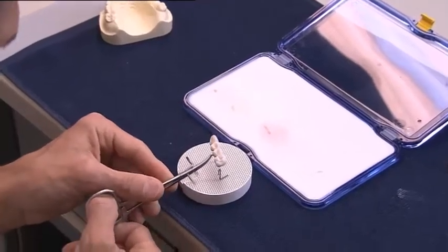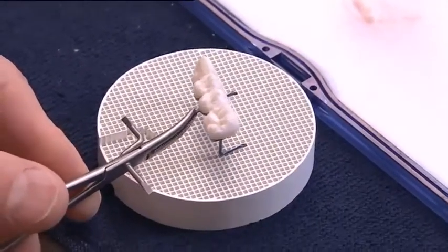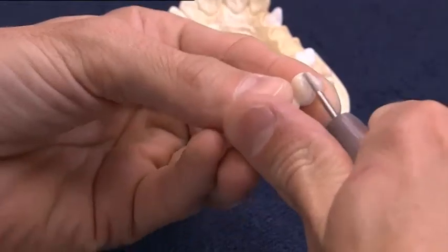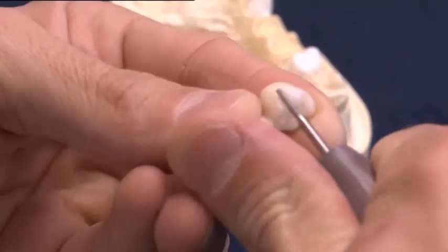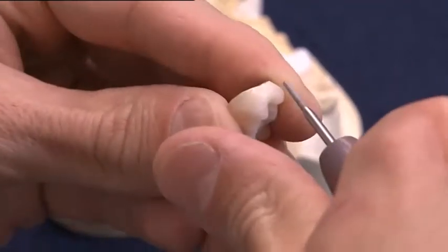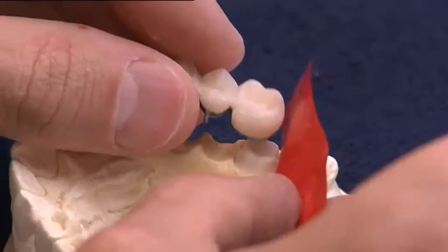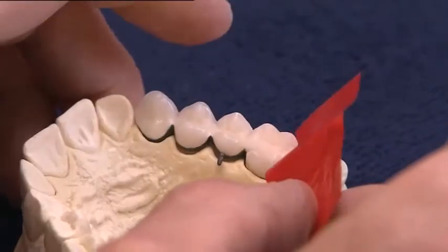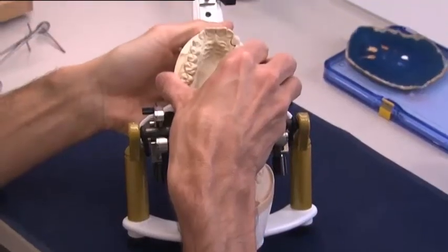Provide adequate support for the restoration on the IPS Unitray and fire the bridge in the Programat furnace. After the second firing, the surface structure is designed and growth lines are applied so that the light is refracted and reflected in different ways. The contact points and function are checked again.